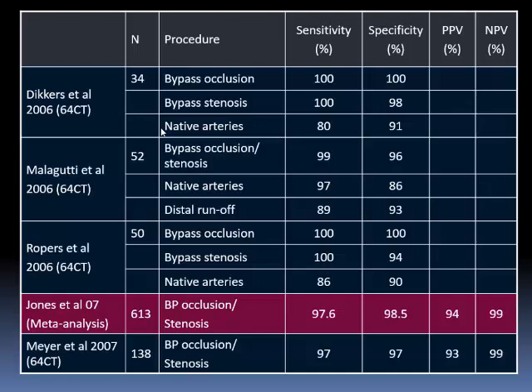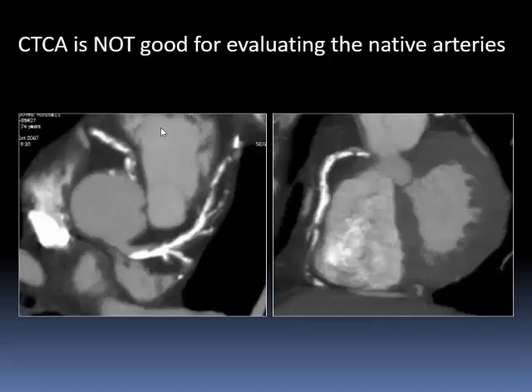And I think in Germany, where they study grafts routinely, I think they do CT angiography yearly for graft patients. So there is some evidence for that, albeit it's not followed in the UK. So in the UK, we limit ourselves to those with symptoms.